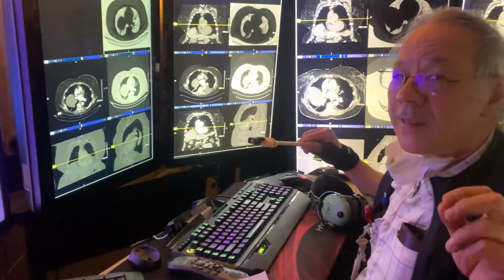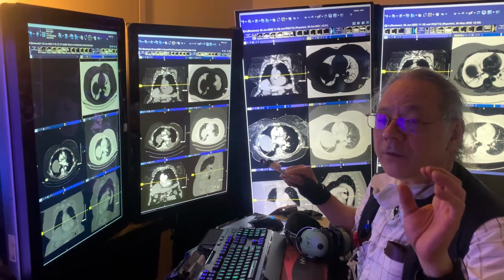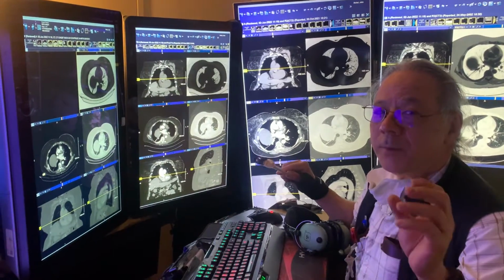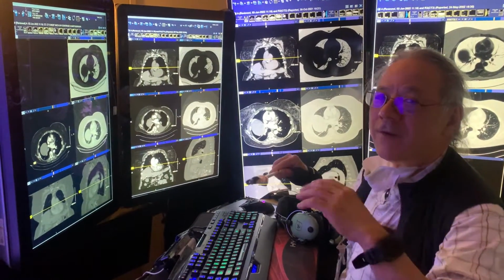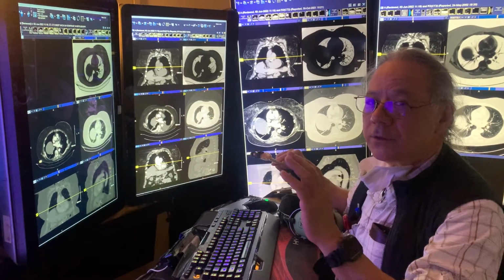We've discussed many things today. I'm going to demonstrate flow. And remember I talked about leaves and forests and seasons and the ability for radiologists to make subtle changes over time. Remember, we are excellent at finding everything. The key is putting it up quickly and assessing change over time.